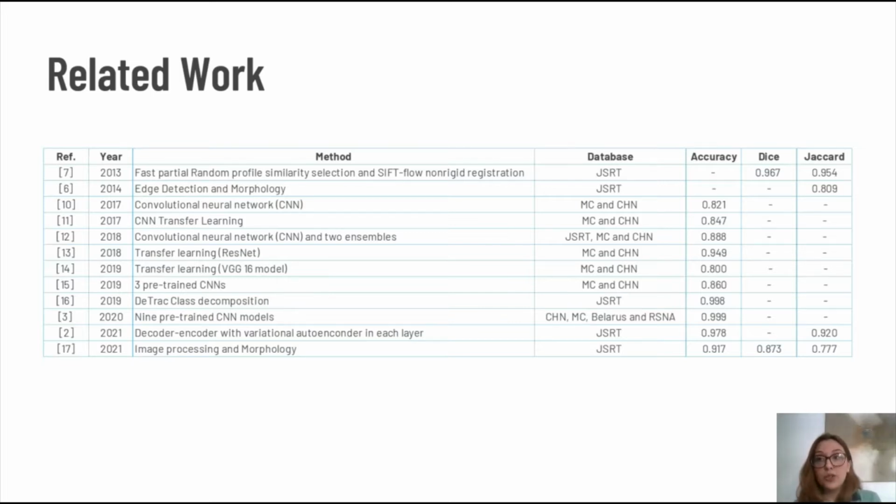Well, when it comes to medicine, finding complete and adequate databases can be really challenging because to produce a great dataset, it's important that it's balanced, which means that the number of samples for a positive or abnormal group is expected to be almost the same as other groups. And we also expect to have diagnoses from different specialists to improve generalization, and that can be costly in medicine.